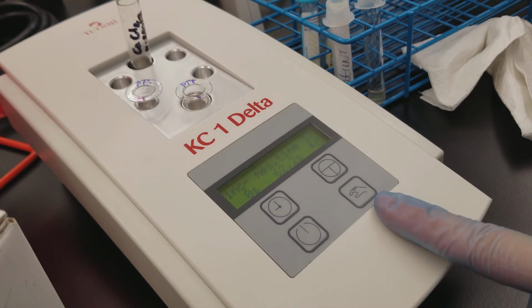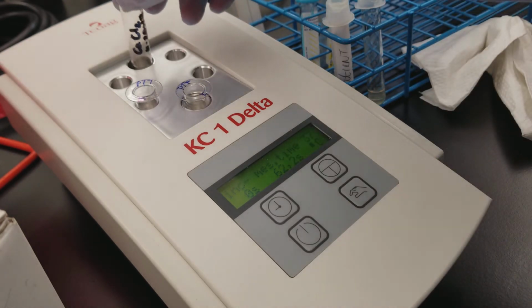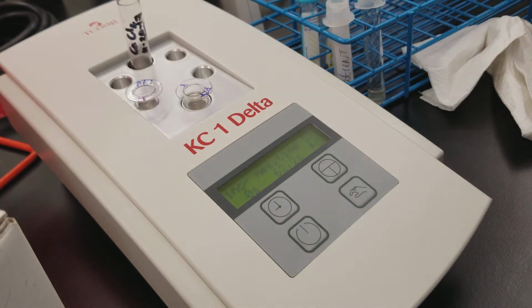So we did that really fast. Now, if this was PT, we don't use the calcium chloride in that one because PT already has calcium in it.